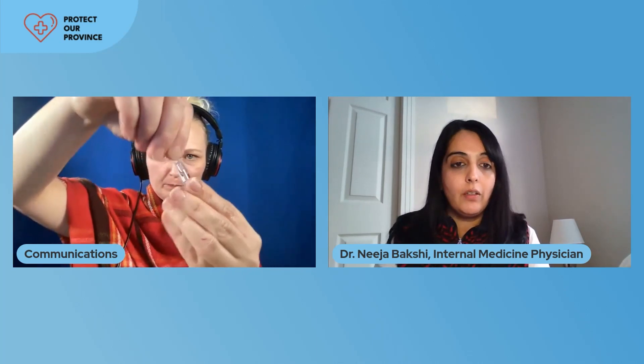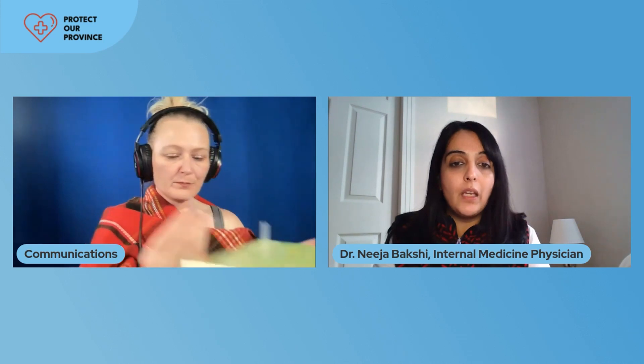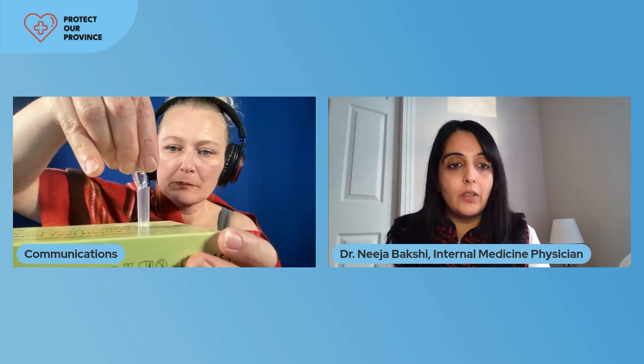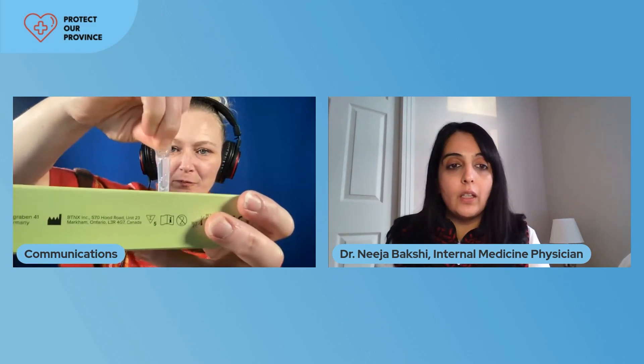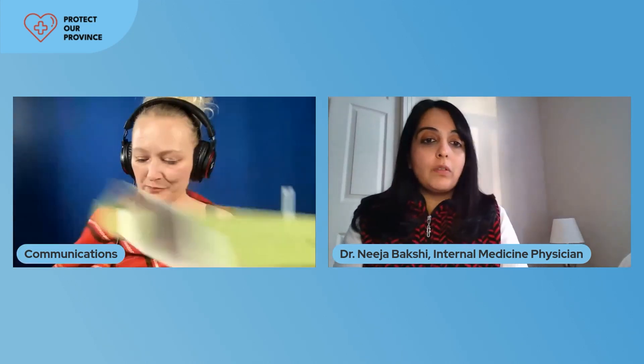Now we're going to put the test down and get our tube and reagent package open. It's just a twist-off top. Then we're going to drop the reagent into the tube — you're going to use all of the reagent for one test; you should not have any leftover. Michelle has used the box as her stand so that she's not having to try to balance with both of her hands. Now the tube is ready to go.